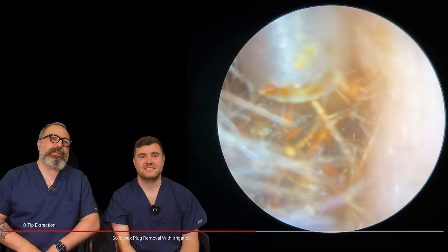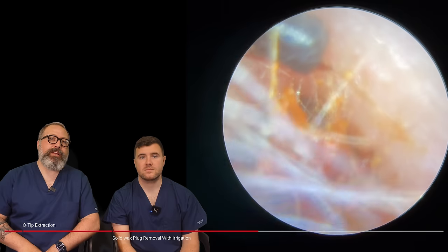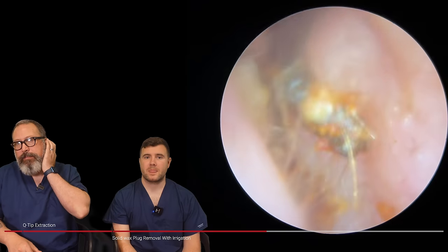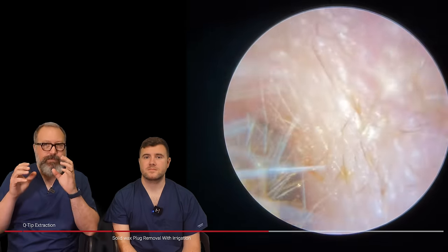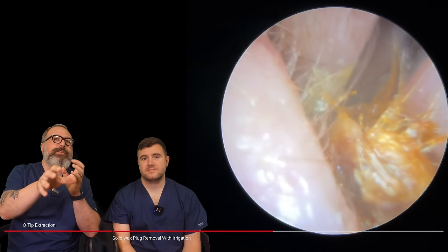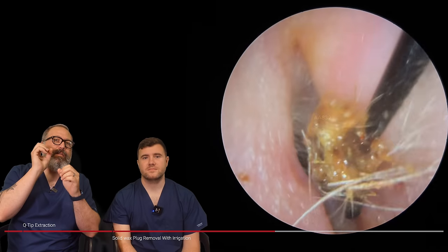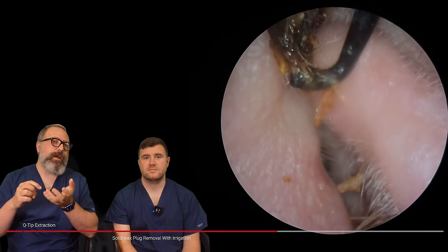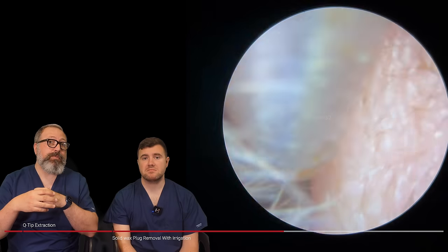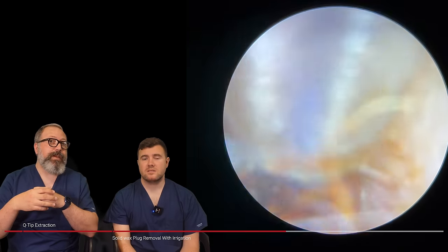So it's coming away nicely now, it's starting to really, really loosen up in here. Still going in with different tools, trying to find the best tool to get in here. It's always a pain when they look really easy to do and then you start. I was looking at this all the way through thinking if I put a Jobson horn in there, it's just going to push it further back. But this is the nice thing about viewing your own videos back — some audiologists don't like certain tools, and you guys will comment saying why didn't you use this tool. Sometimes in the moment I thought I didn't have enough of a gap to get the Jobson horn over, but looking at it now I probably could have got it in there and it probably would have worked a little bit more effectively. That's the benefit of going over your own work.